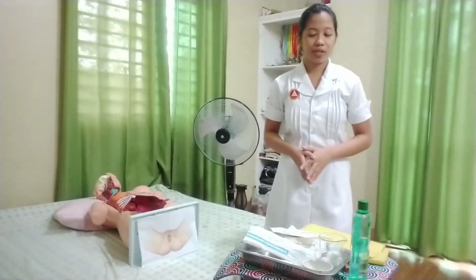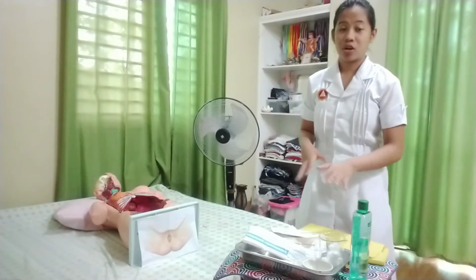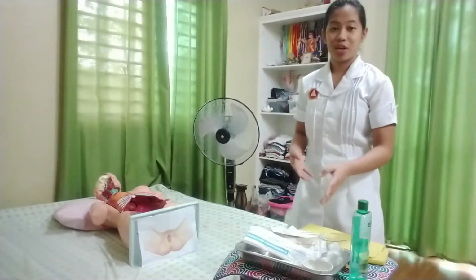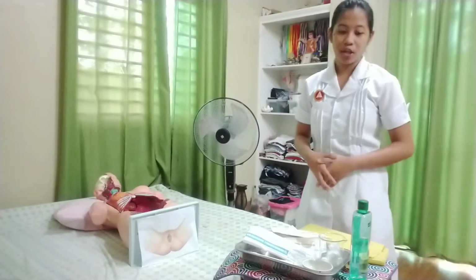Now the goal of this procedure is to safely introduce the catheter into the bladder of the client to promote urine drainage. So for my equipment, I will be needing a sterile catheterization kit, and the sterile catheterization kit has the following: sterile gloves, sterile drape, the type of catheter we will be inserting, which might be straight or indwelling, a prefilled syringe with sterile water, lubricant, antiseptic solution, cotton balls, forceps, urine bag or drainage bag, and the waterproof pad.